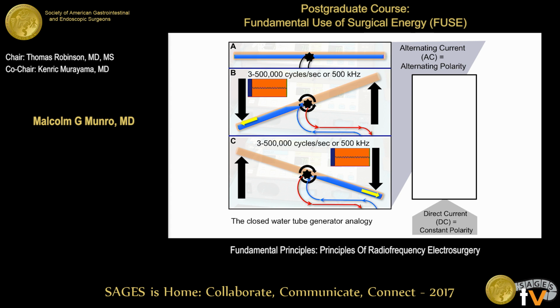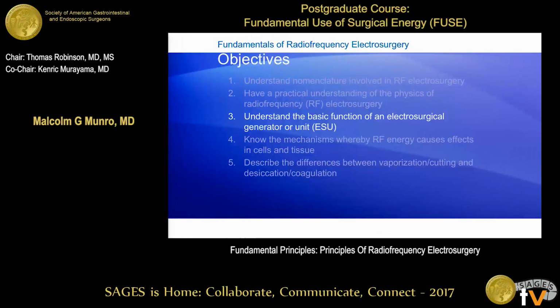So the whole concept of return electrode makes absolutely no sense because electrons are going back and forth. In fact, they're more likely oscillating than they are traveling in a circuit. Okay, so all the circuit diagrams should have arrows going both ways, where the direct current is more like a racetrack. The polarity is constant, and the electrons move around a circle.